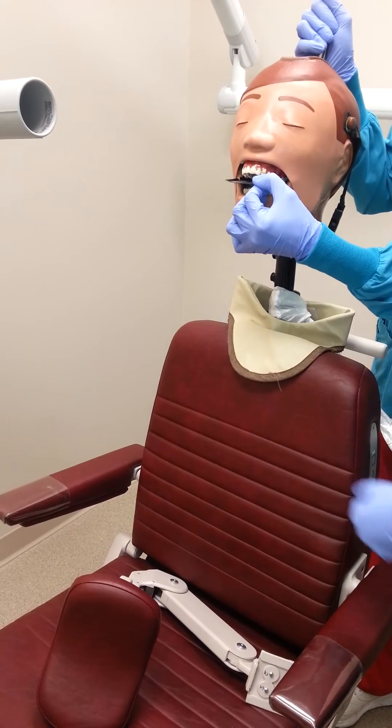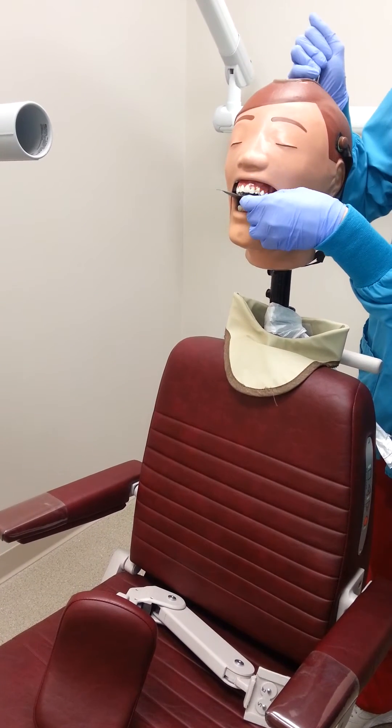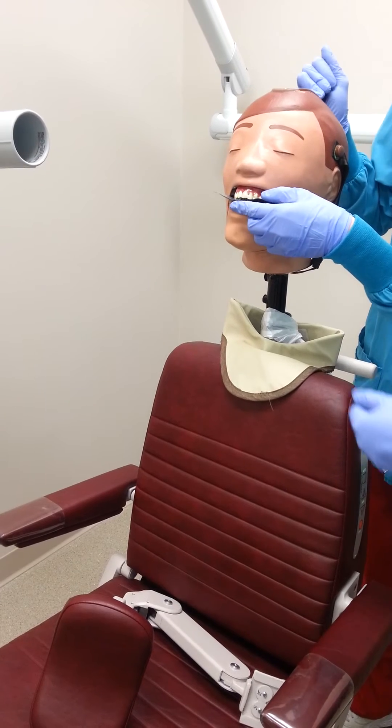When placing the size 4 phosphor plate, we need to make sure that a minimum of 1 cm of the film is anterior to the mandibular central incisors.